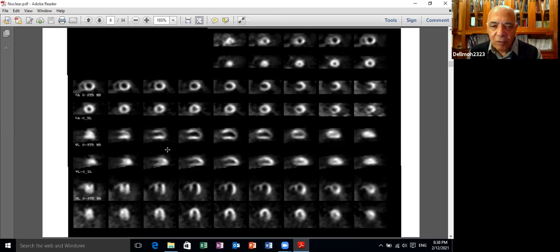And if you look into the perfusion scan, you will find here during exercise, the LAD territory here, there is a filling defect here, it's black. During rest, it fills here. If you look into the diaphragmatic wall, it's less apparent, but the diaphragmatic wall is again, there is a difference, and the anterior wall.